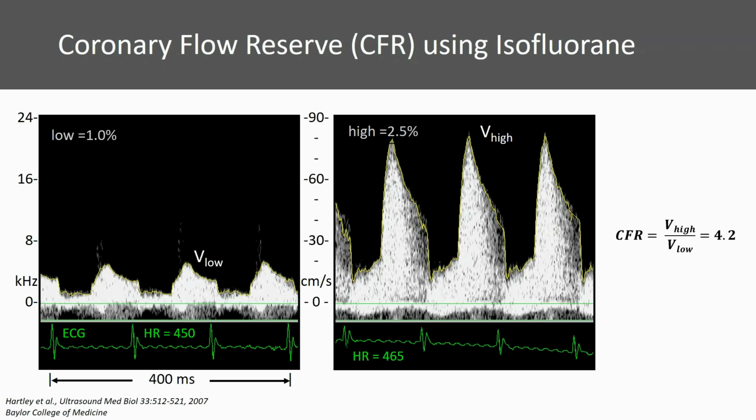Similar measurements may also be made using drugs or compounds to induce vasodilation. The same technique may also be used in any type of surgical model, including TAC, permanent occlusion, or ischemia reperfusion models as well. The key here is to obtain the coronary flow reserve measurement before surgery so that you have the control of the same animal and can follow the progression over the course of your study.